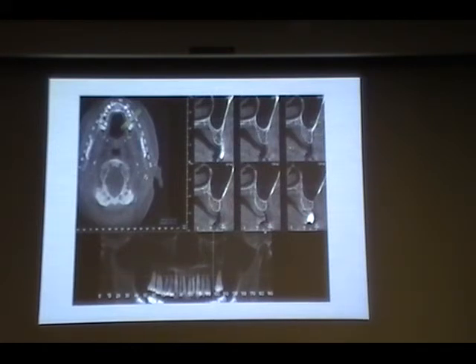So here is an example. A case came from a periodontist. They were unable to figure out that there was a sinus discharge. That's the chief complaint. And they wanted to place an implant in this region. So this is the 11, 12, 13, 14 region.